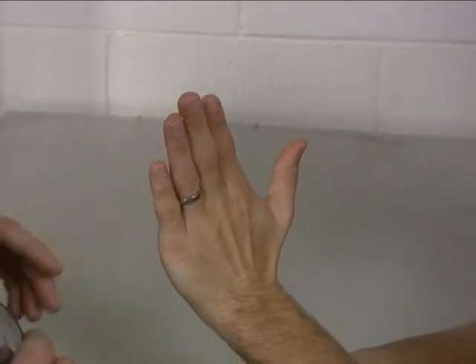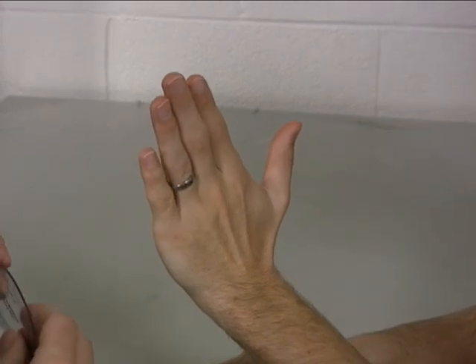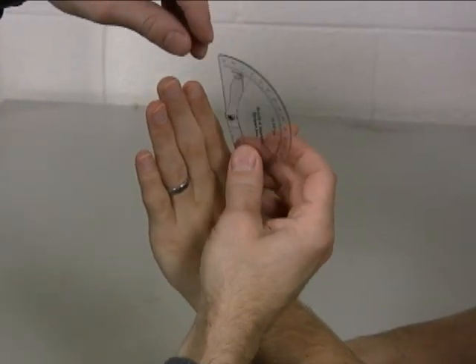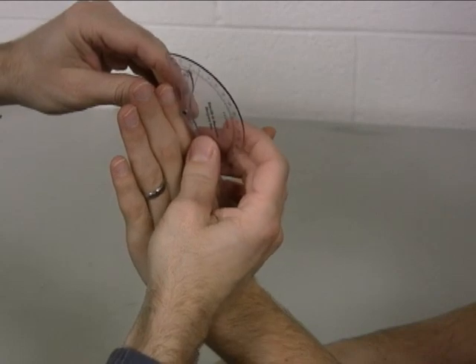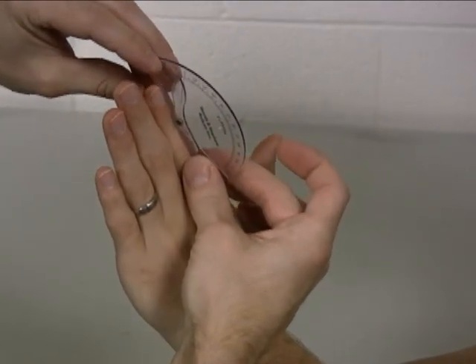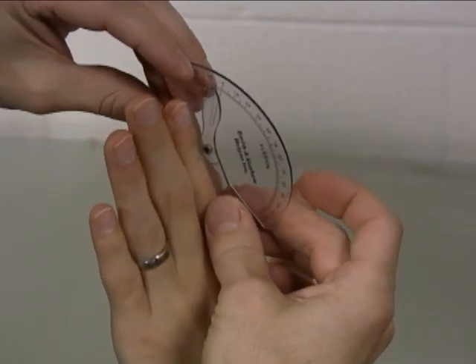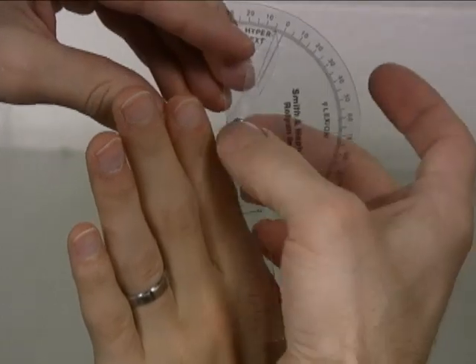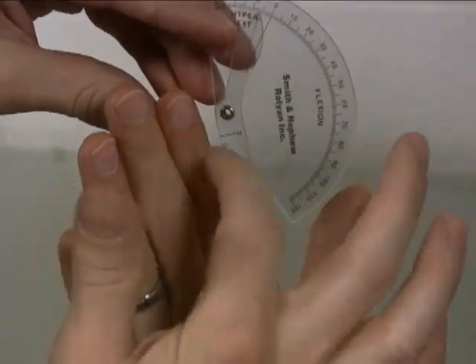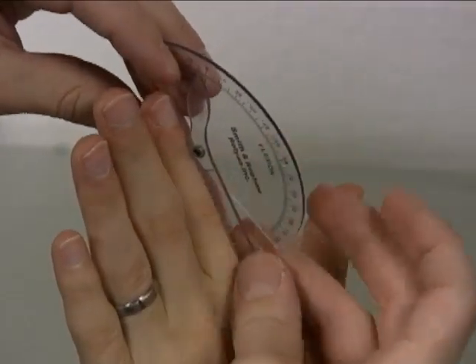To measure finger distal interphalangeal joint active range of motion, you're going to take your goniometer, again, place it on its edge on the back of the finger, and with the axis of the goniometer centered over the distal interphalangeal joint.